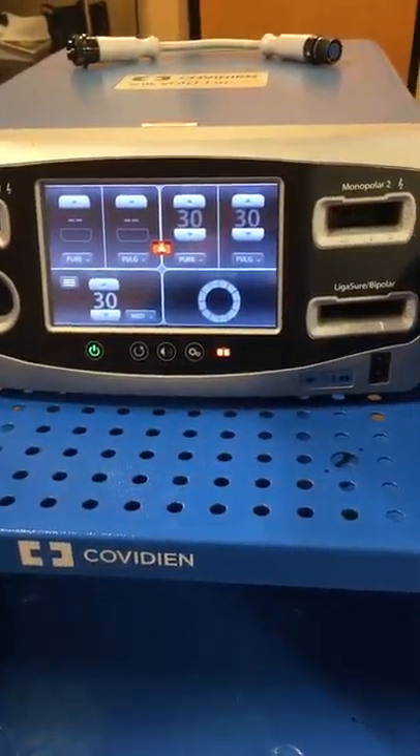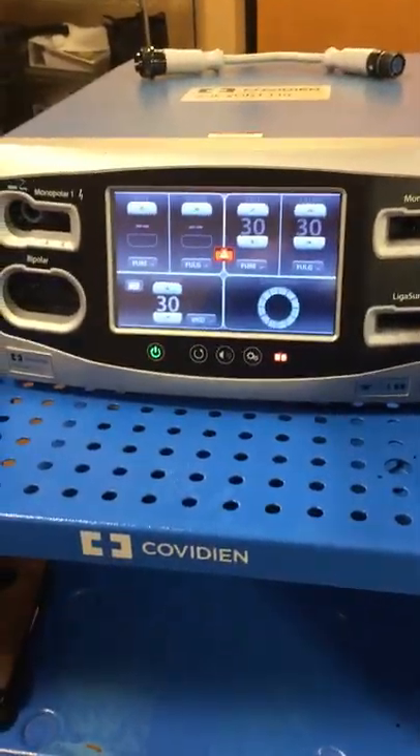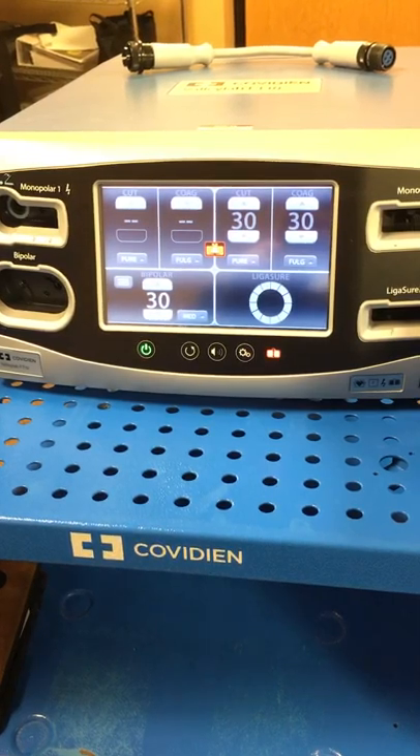Hi everyone, my name is Kristen. I'm the local Medtronic rep here at the hospital. I'm going to be walking you through the ValleyLab FT10 electrosurgery generator. This is our newest machine on the market.